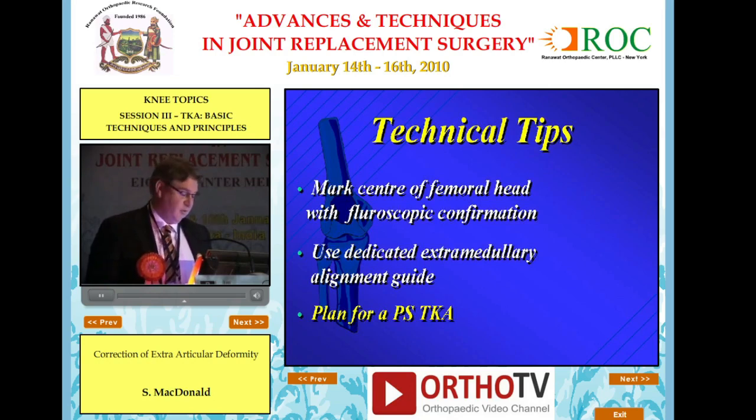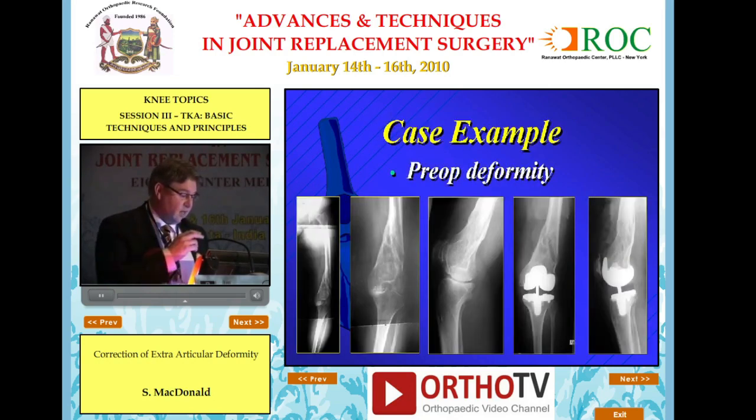It will simplify the process. So here's a case example. It's actually the first one I inherited in practice. So this was done in '96. This preoperative deformity presented, post-traumatic, previous fracture.